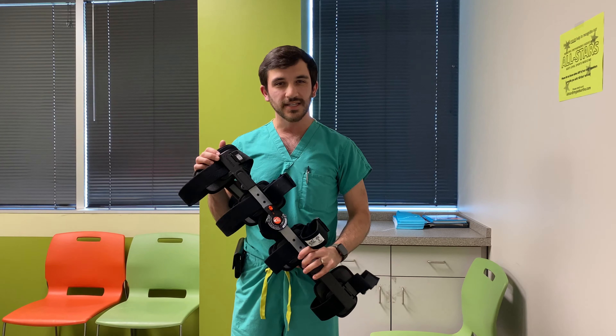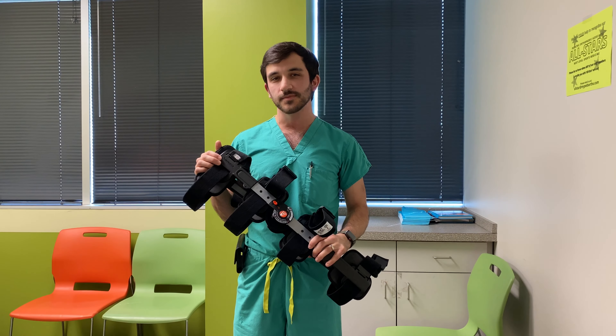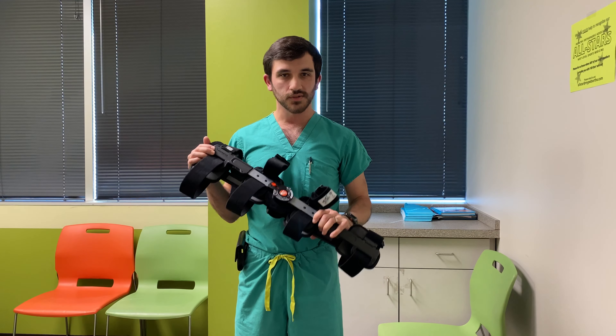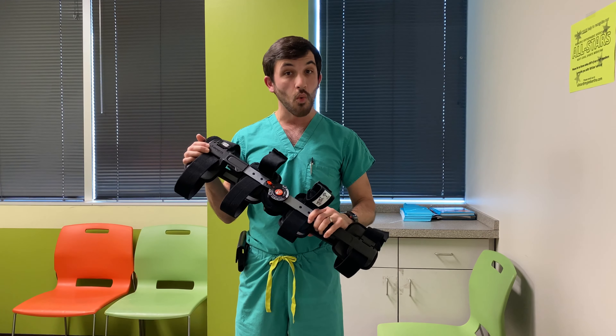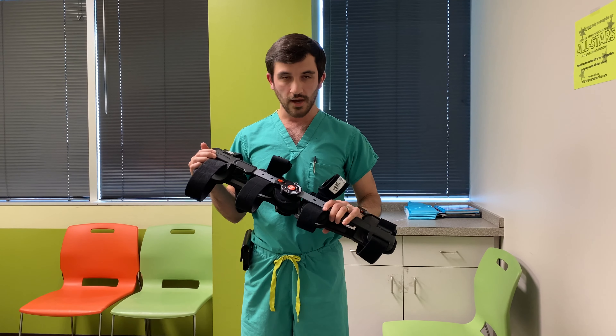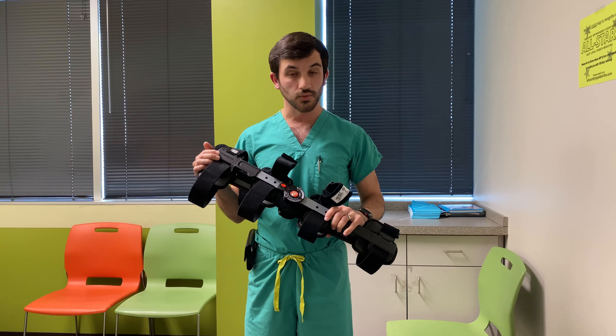Today we're going to take a look at the Bregg T-Scope. We use it a lot of times after knee surgeries to help restrict range of motion and also remind folks not to go wild after their surgery. We also use it sometimes in the acute setting in order to help some injuries restrict the range of motion.